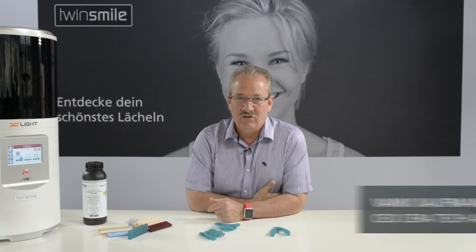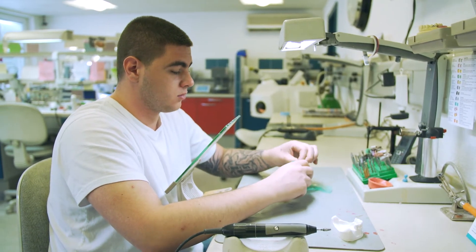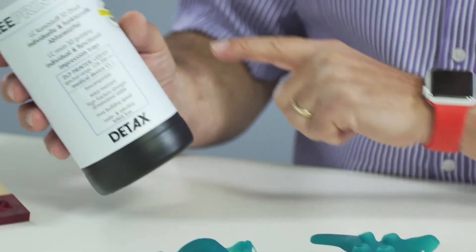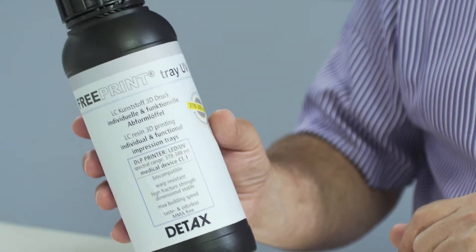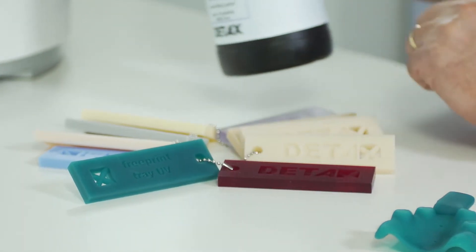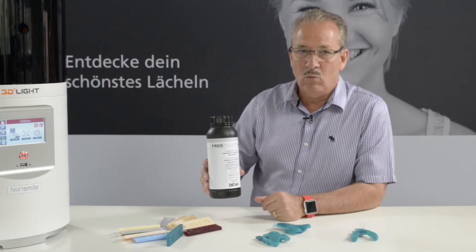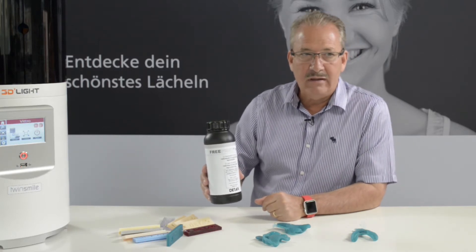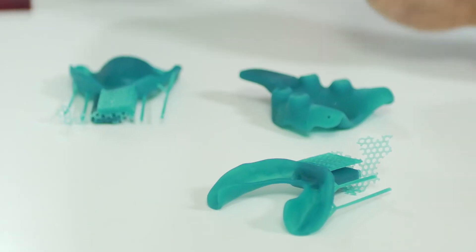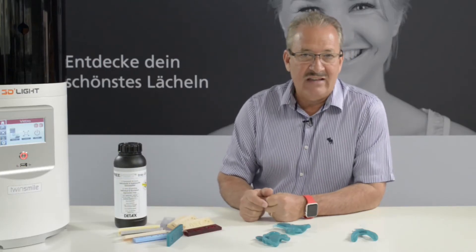For us it's very important to produce custom impression trays in the lab. We still do a lot of these trays and we are using for this purpose a liquid from Detax called Free Print Tray UV. It's a material which has a bluish-greenish color and it's a medical product class 1 biocompatible. That means the trays produced with this liquid can be used for impressions in the mouth.